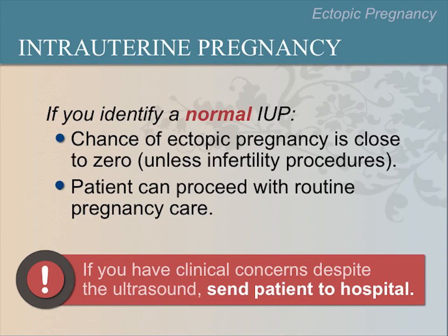For the care of a patient that has not had infertility procedures, identification of a normal intrauterine pregnancy means that she can proceed with routine pregnancy care. But if you have any clinical concerns, despite the ultrasound, don't hesitate to refer the patient to the referral hospital.